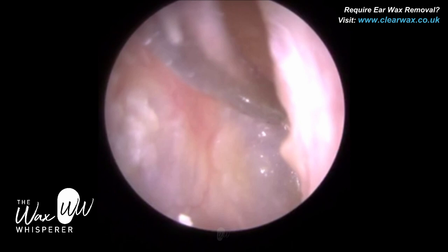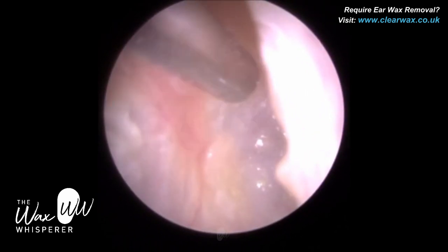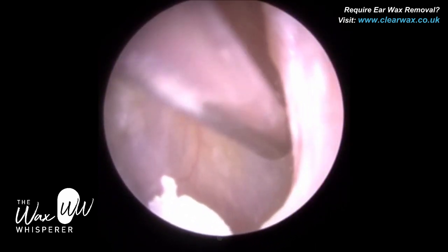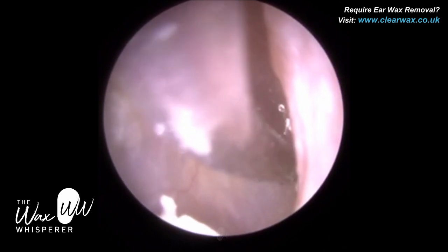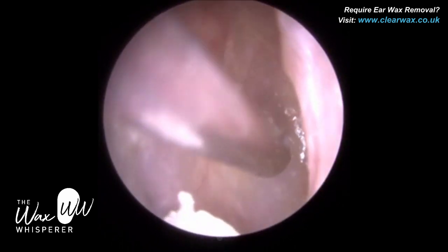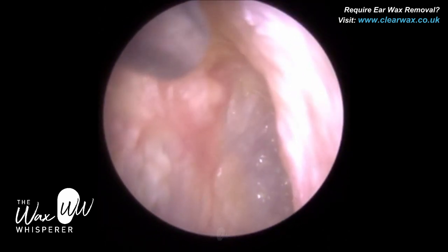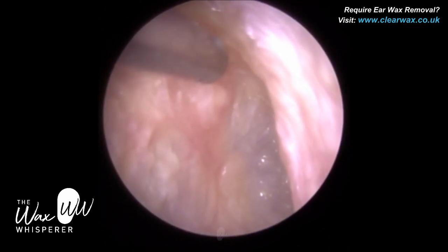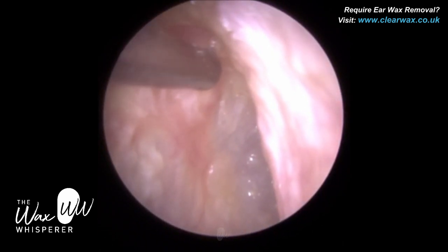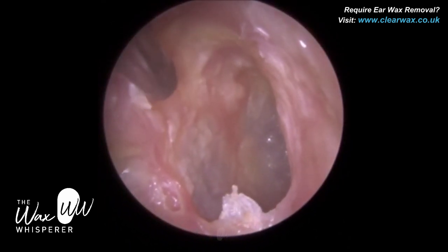There is also a dead layer of skin coating the ear canal that has got wet because of the sodium bicarbonate drops. I'm using the fine end to remove as much dead skin directly off the eardrum. I'm in the anterior recess here, and I've created a 30-degree bend on the fine end gauge, which enables me to enter the anterior recess. Without that bend, the fine end gauge would make contact with the anterior canal wall, and that portion is bony, so it would be very uncomfortable.